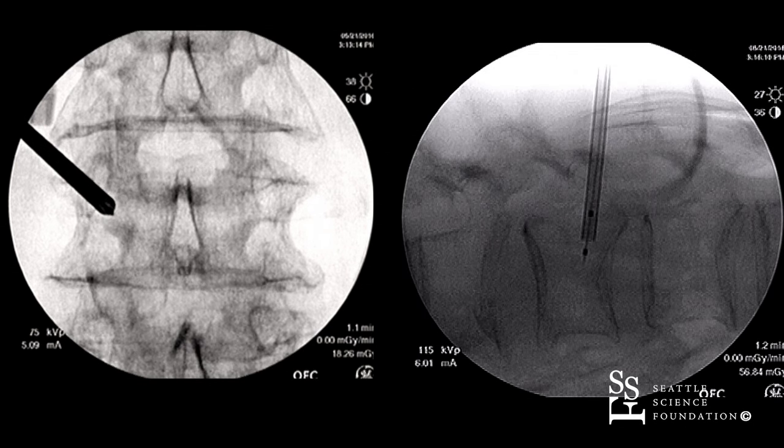As you can see, there are markers that allow you to know whether or not you're adequately past the introducer to make sure that the balloon can inflate.